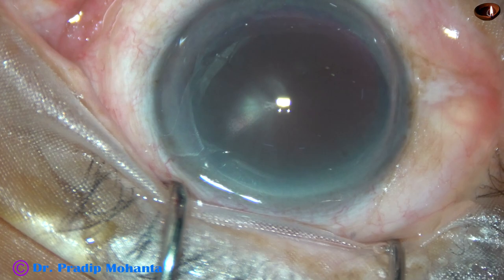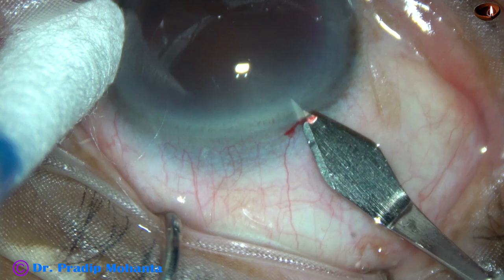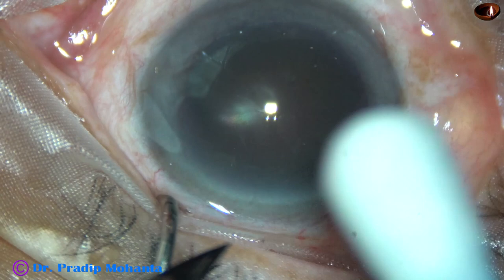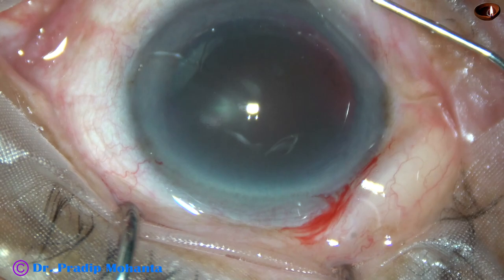We are going to observe the full surgery in this case. The surgery has been started. This is the main incision with a 2.8mm steel keratome, and this is a 3-planar incision. Now this is a side port on the right side of the main incision, about 3 o'clock hours away. And this is another side port on the left side of the main incision, about 2.5 o'clock hours away.